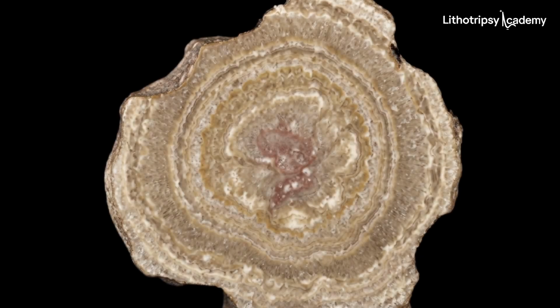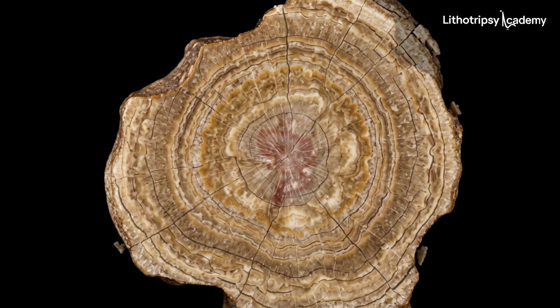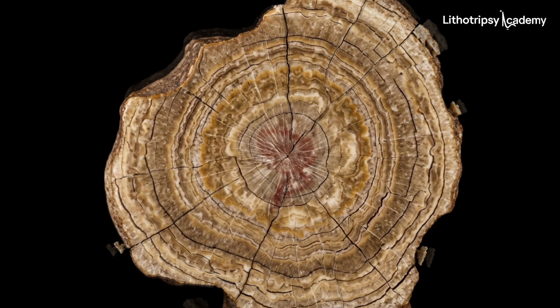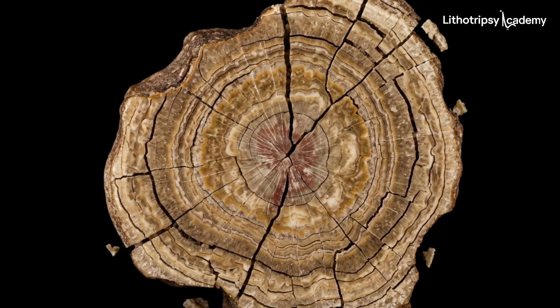Some layers are dense and hard, others are softer and more brittle. These layered structures create natural weak zones inside the stone. When shock waves enter such a stone, they do not travel evenly. They reflect, refract, and concentrate stress along the boundaries between these layers. That is where microcracks form, and those cracks are what drive effective fragmentation.